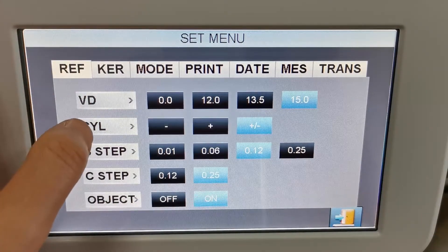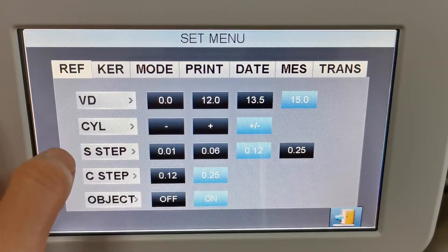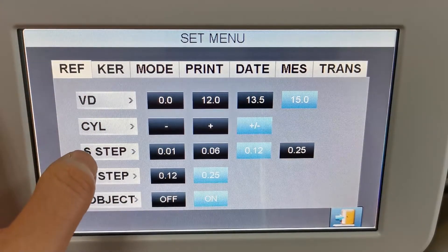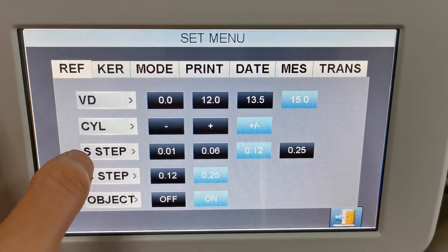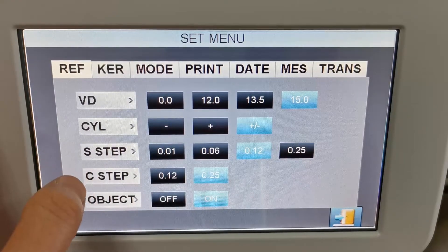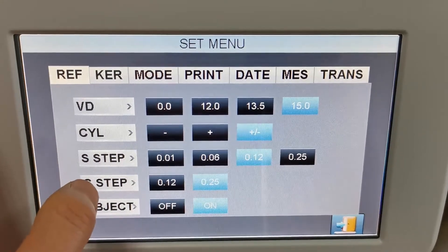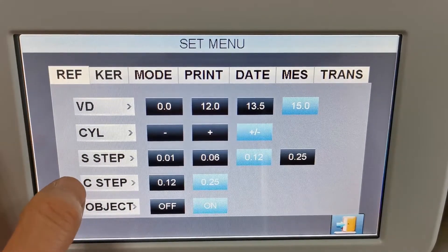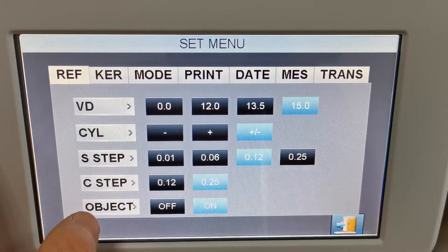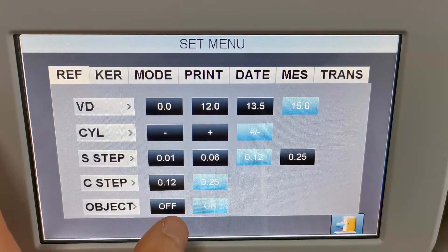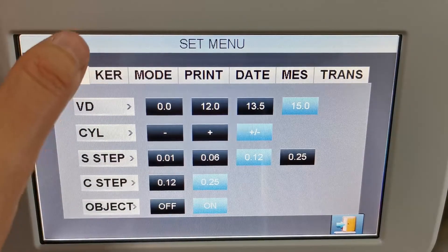the cylinder mode, the step for sphere, and the step for cylinder measurement. The object can be turned on or off.